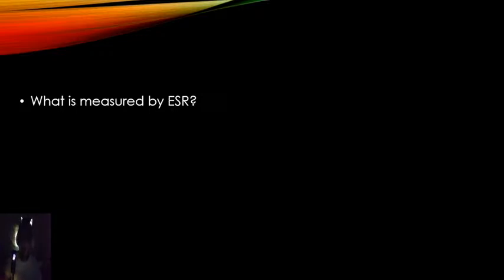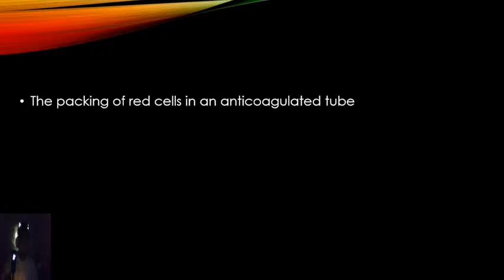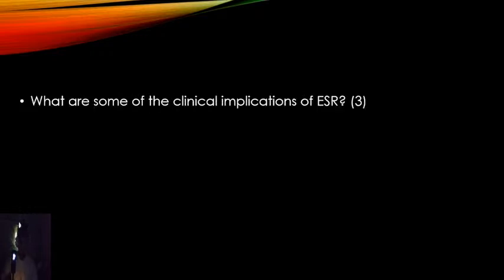So it measures the packing of red cells in an anticoagulated tube. Some of the clinical implications or usage of ESR are the following. There's three things that it's useful for.